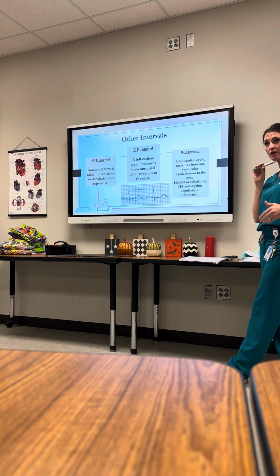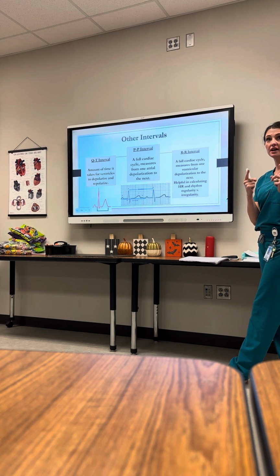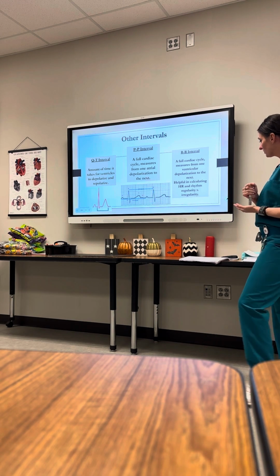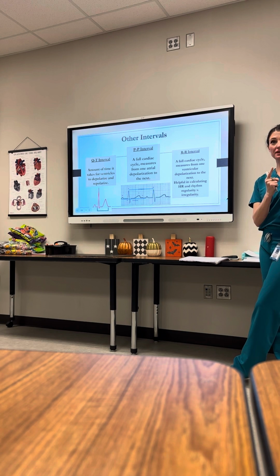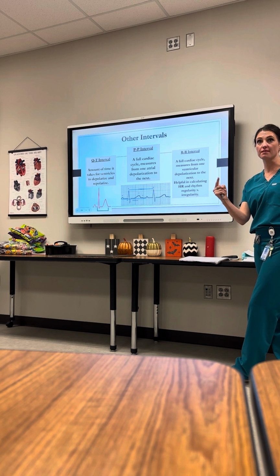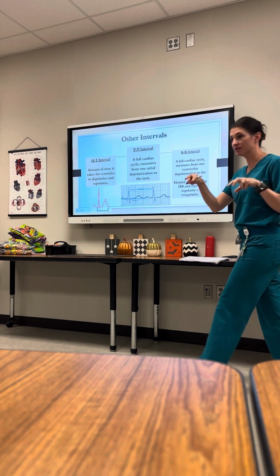And let me just say it again for repetition. The R to R is used in discovering if a rhythm is regular or irregular. I'm going to teach you more about that tomorrow. And we also use this R to R interval to help us determine a patient's heart rate, okay? I'm going to teach you some cool methods tomorrow. There are times where you might be looking at the P to P interval separate from the R to R interval, and they might not be the same. And we'll talk more about that tomorrow. So you need to know that they're both a thing and how you would look at those intervals.